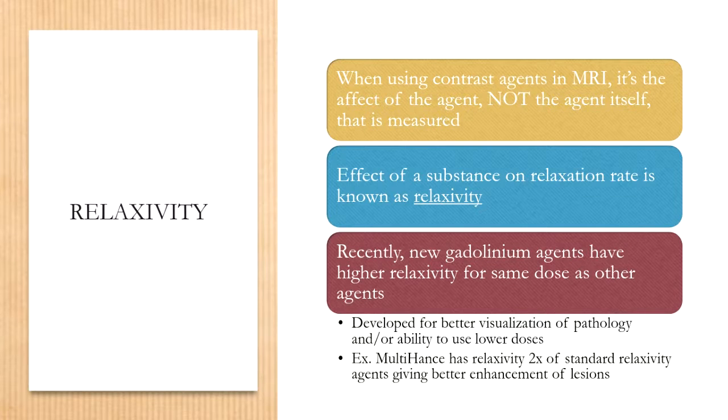So if you look at those two bottom pictures, the bottom right and the bottom middle, notice how the bottom lesion, as well as the lesion in the frontal hemisphere, the frontal lobe, notice how they are enhancing significantly from the far left image through the middle image and then to the far right, single, double, and triple doses. And so notice how initially we have a pretty significant contrast on the single dose. When we go to double dose and triple dose, that contrast signal, the signal of the water molecules, is incredibly high.